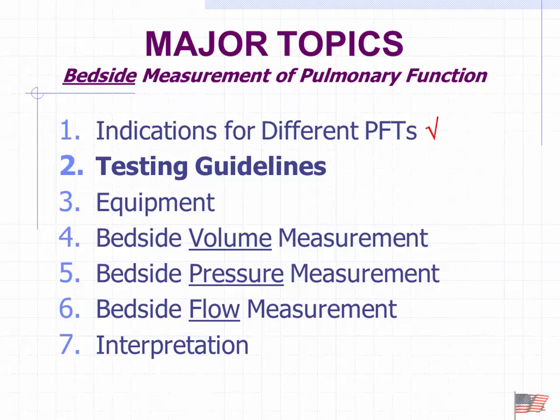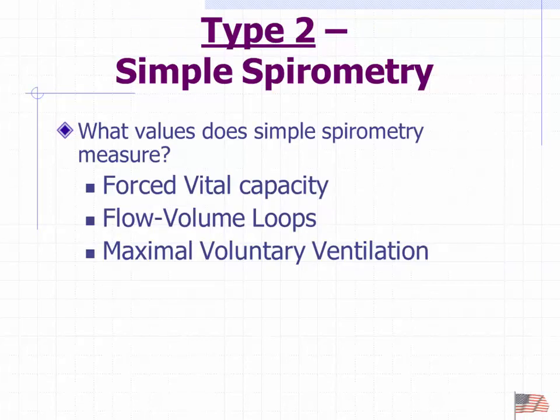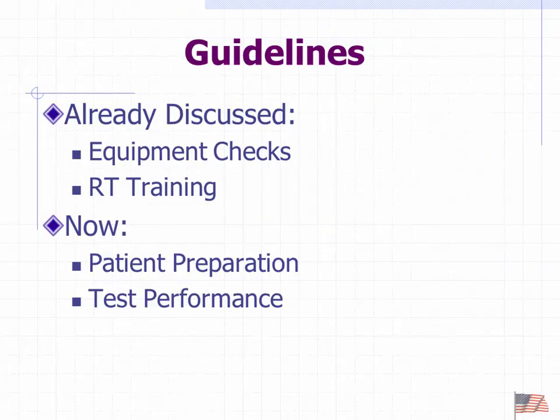We talked about preparing the patient and preparing the therapist. So, simple spirometry measures the forced vital capacity, can measure a flow volume loop, and we can use it to do maximal voluntary ventilation. And we talked about all the things in a complete PFT. I'm skipping through these, they're kind of duplicate slides.